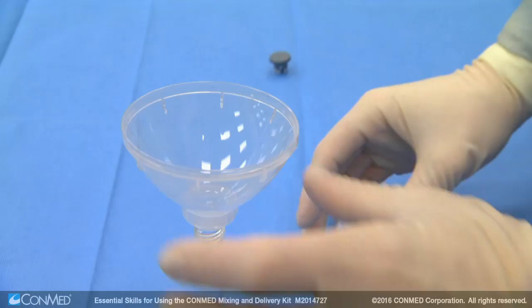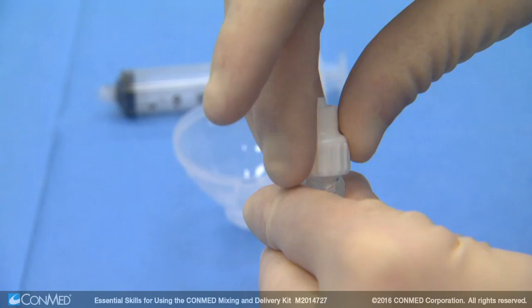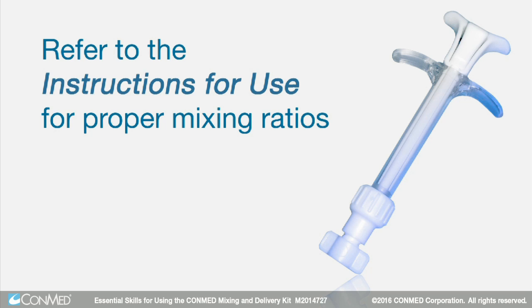Next, pour allograft, autograft, or synthetic bone graft material into the funnel. Pour the fluid referenced in the IFU into the syringe. Then remove the funnel and secure the syringe cap and lure cap. Refer to the instructions for use of the material for proper mixing ratios.